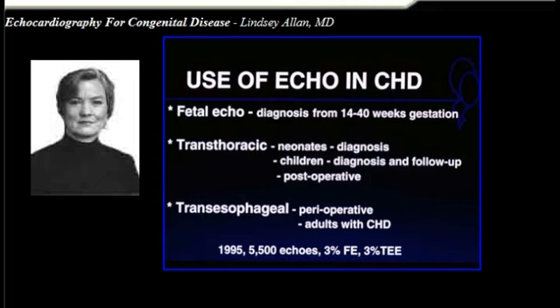Echocardiography for congenital heart disease, the difficulty is knowing what to leave out, because obviously echocardiography is a very big subject in pediatric cardiology. It's of much more importance to us as cardiologists for children than it is in adult life. And for surgeons, it's also very important because in many cases it's all the information you're going to get.